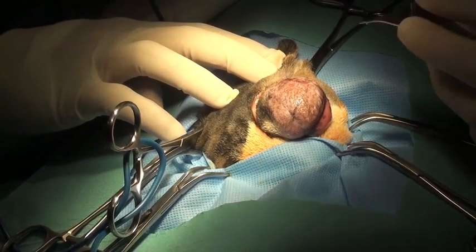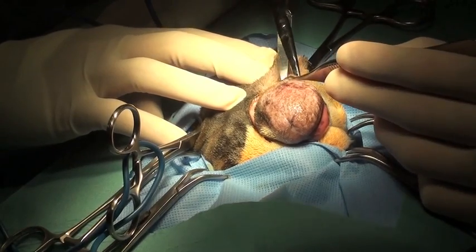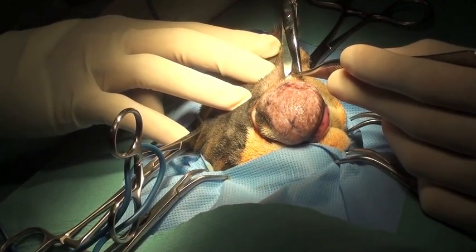Excision is performed as a combination of electrodissection and blunt dissection.